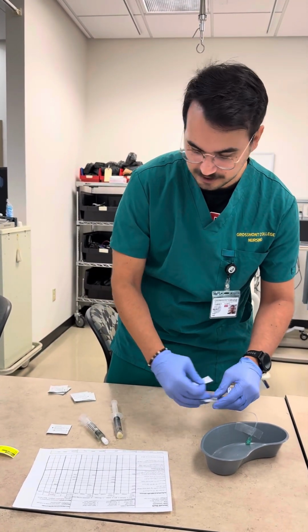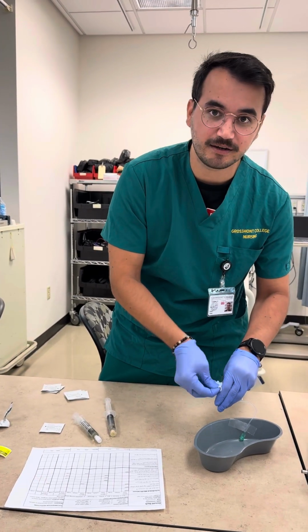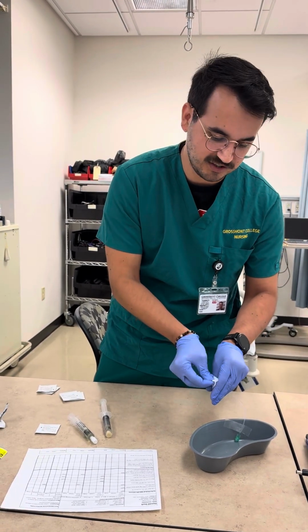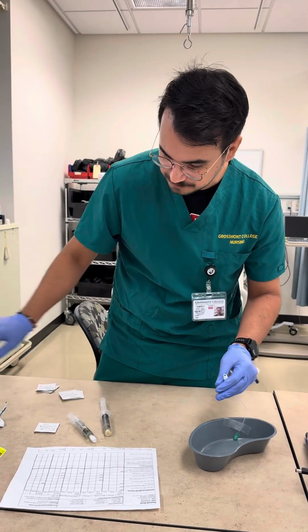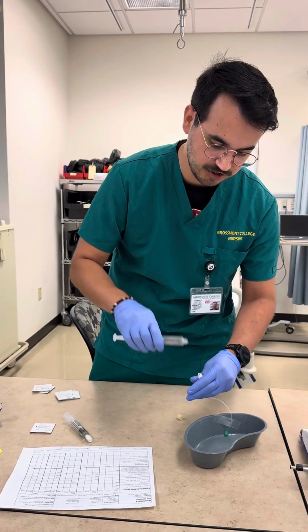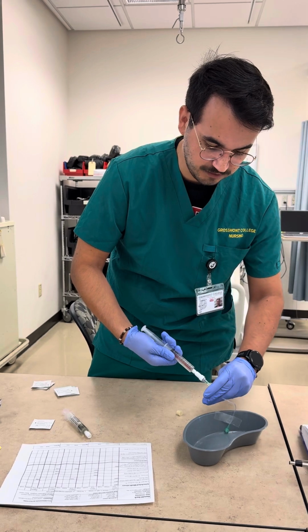So I would take my alcohol swab and brush this area for 15 seconds. Now, 15 seconds is kind of a long time, as well as 30 seconds later on. So I'm just going to indicate that I've done this for 15 seconds. Throw this away. Take my sterile flush. Place it right here. Undo this.